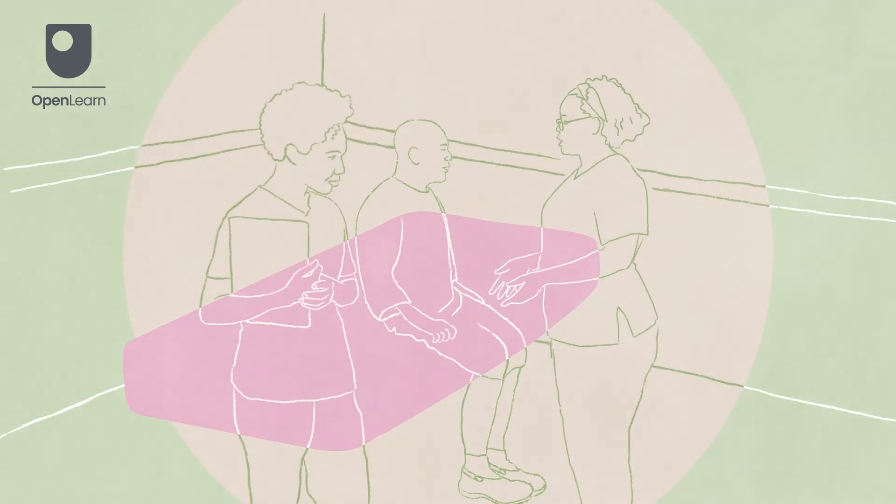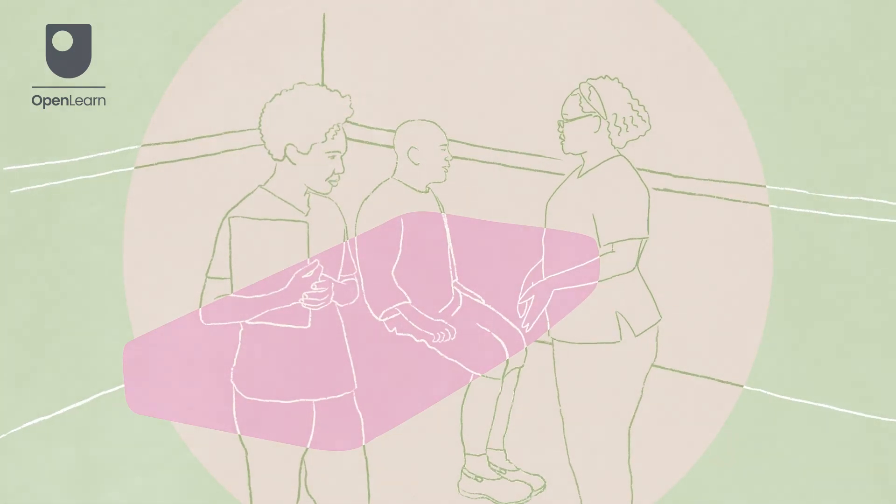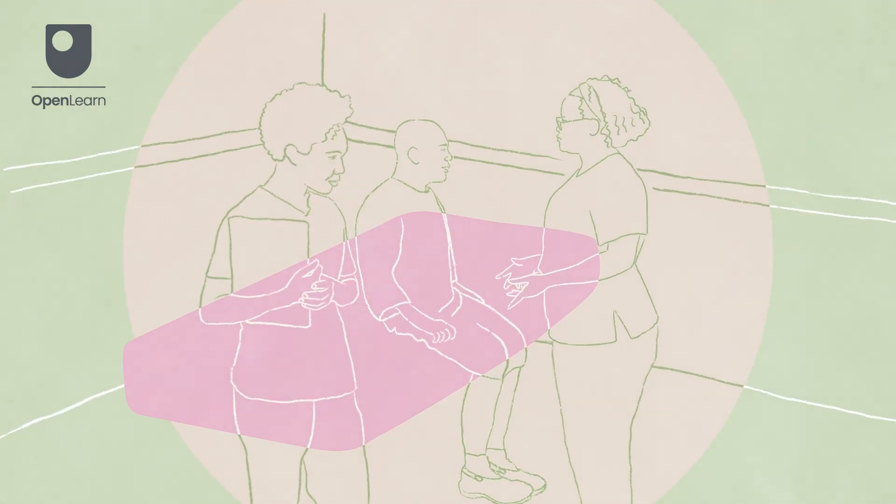You can now inform the patient that the assessment has finished. If necessary, assist them in replacing their clothing and into a comfortable position. Remember to explain your findings to the patient, asking if they have any questions.